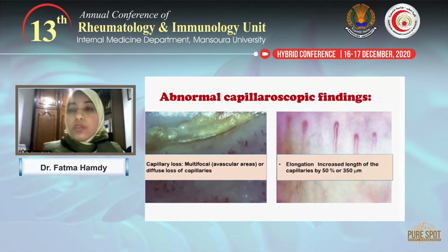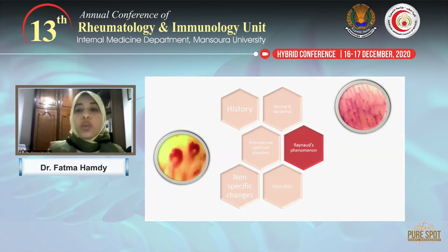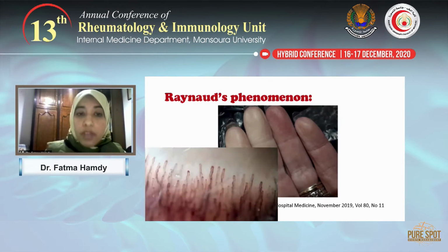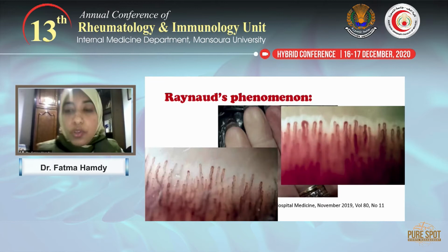Next, we will talk about capillaroscopy and its role in Raynaud's phenomena. As we all know, one of the most important indications for doing capillaroscopic examination is Raynaud's phenomena. It's used for differentiation of primary Raynaud's phenomena, in which the capillaroscopic examination is entirely normal, and secondary Raynaud's phenomena.